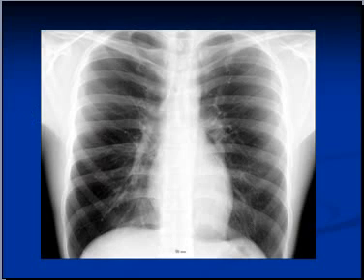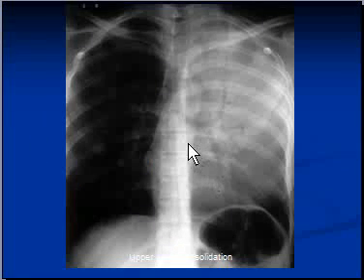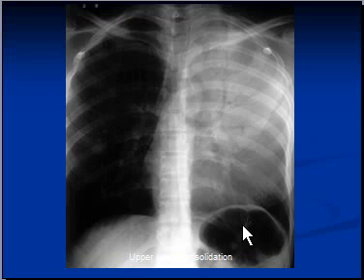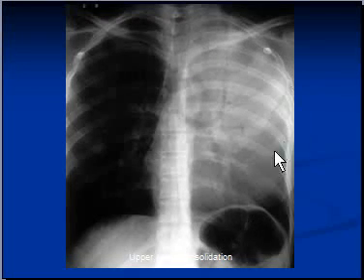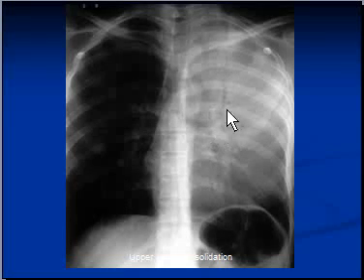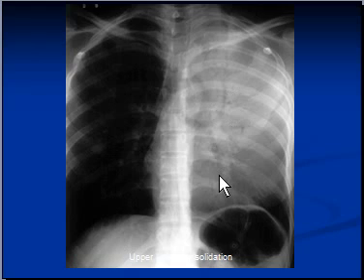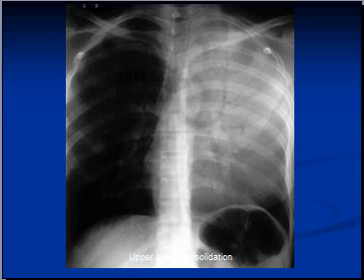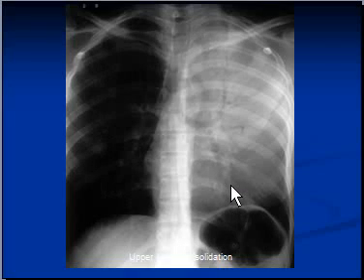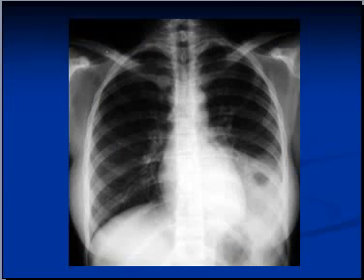In the second X-ray, the left heart border is completely obliterated as a result of consolidation in the left upper lobe. Notice the air bronchogram in peripheral branches of the trachea, which has become clearly visible because of loss of the normal density of aerated lung. This is the silhouette sign — the left heart border is not visible.